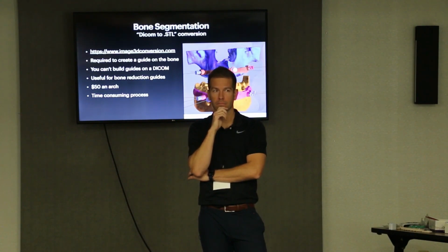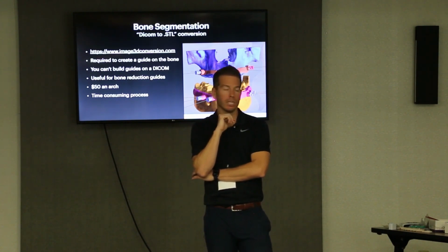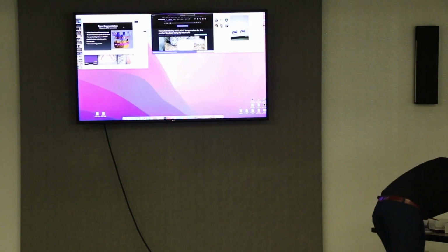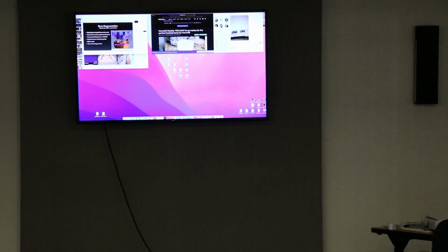I've tried that, but the flap is thin, and then all of a sudden that duplicate denture really doesn't fit over it. It's like it's sitting on tissue, folded over. When they're real thin, I've struggled with that too. I've had to really eyeball it. Are you getting the sleeves in that, or do you just have a window in the denture? No window?